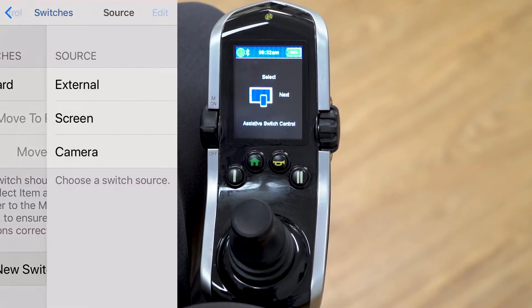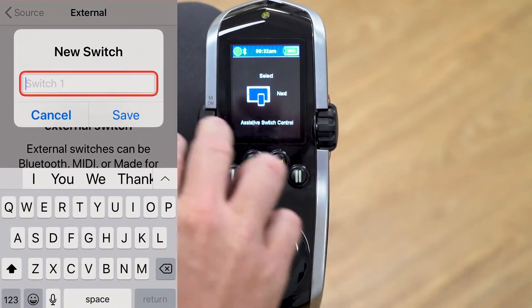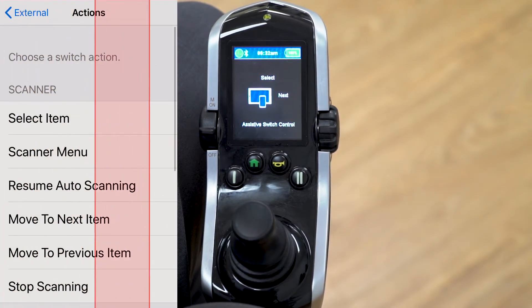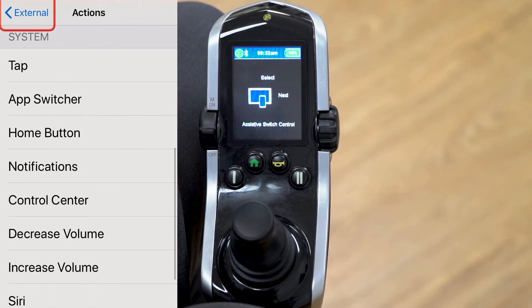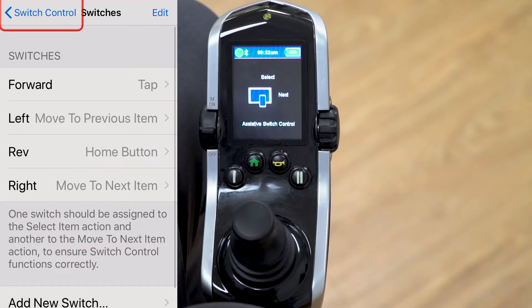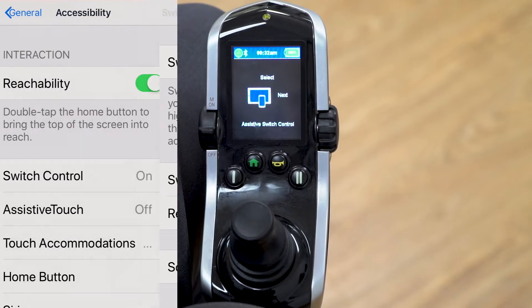For the last direction, click add a new switch, choose external, give a reverse command, name it 'reverse,' and save it. Assign this one as the home button — just like hitting the home button on your iPhone. Everything is now assigned, so exit switch control.